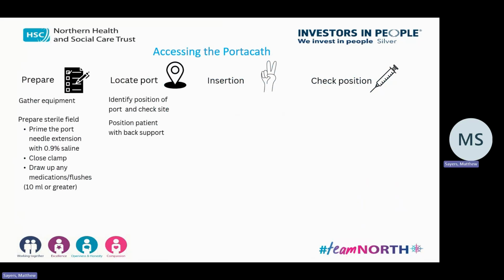This is really important, the position of the patient, and they need to be against something, whether that be the couch that they're on or on mommy's lap or whatever. They need to be against something, because if you think you're pushing quite hard in, if there's nothing behind them, the child's just going to go back and you're not actually going to get through. So the position of the patient is important too. And it's thinking about things in children, like, mom's probably seen this 100 times. What works best? What position do you normally use? What are they less troubled by?